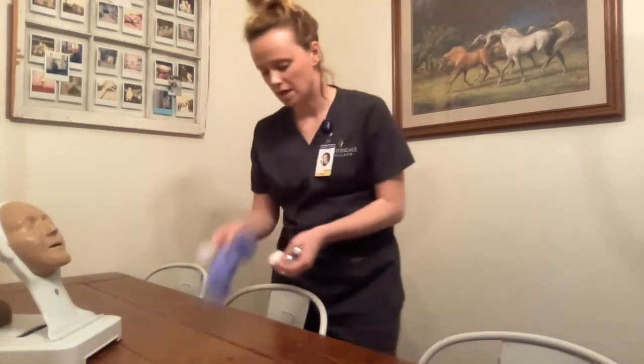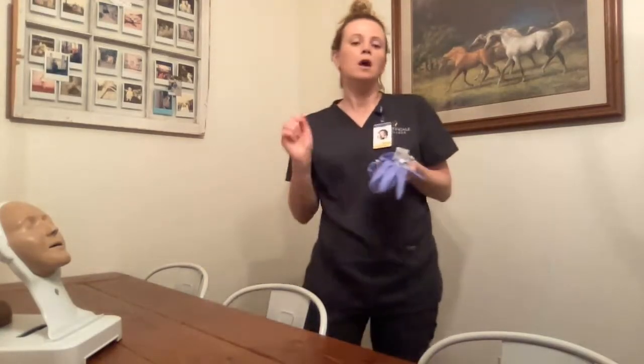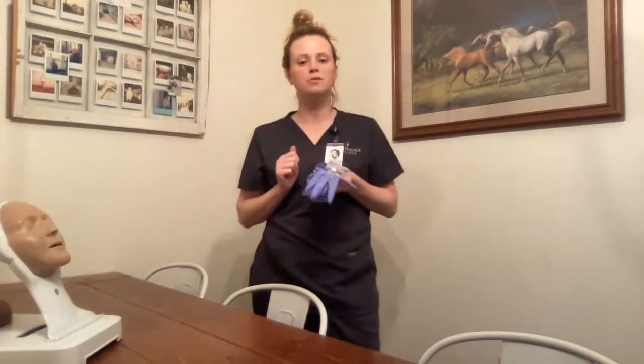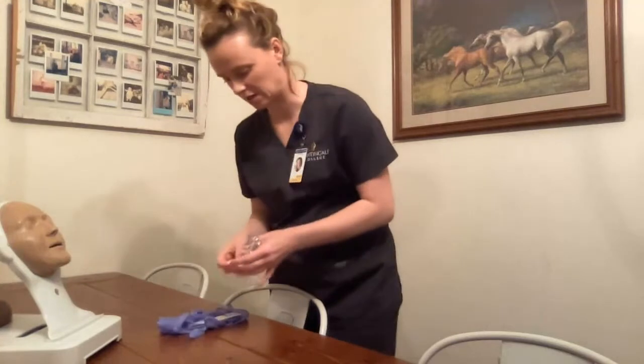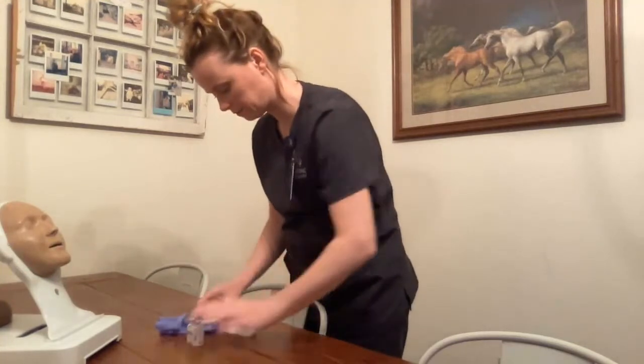I gather my supplies and head to my patient's room. I knock and enter, close the door behind me to ensure patient privacy and to avoid any HIPAA violations, and set my supplies down on a clean, dry, flat surface.